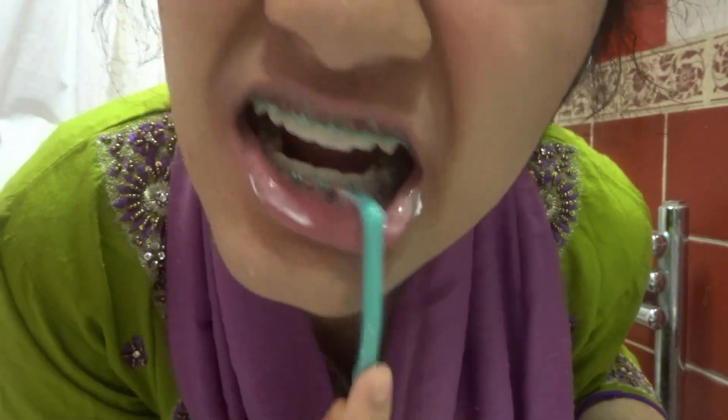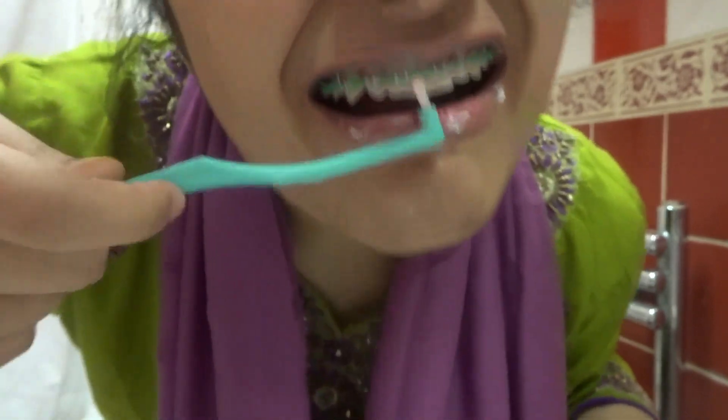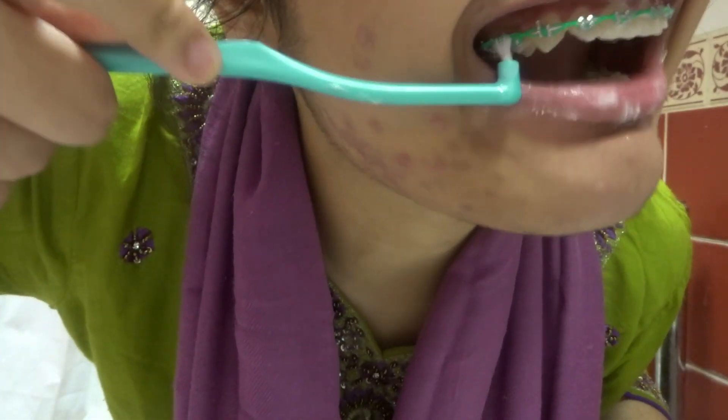I cut a piece and go right at the back of my teeth — you can see I go right to the back here with it.